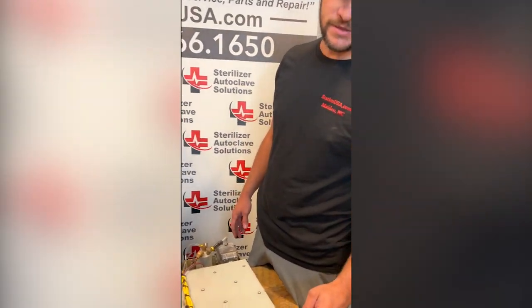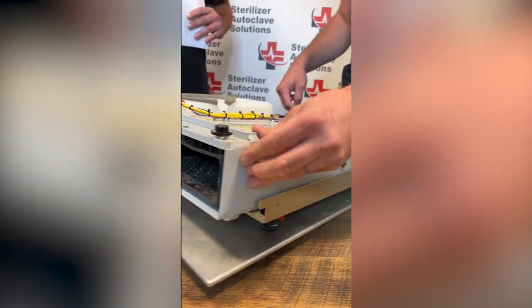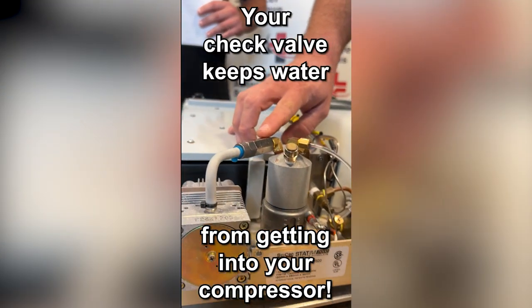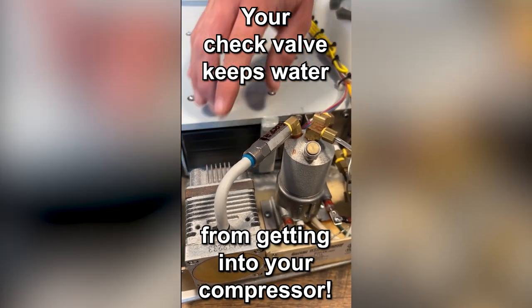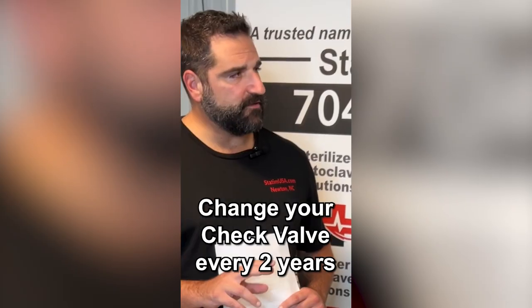He ended up purchasing a cassette seal from us. Also with that PM kit that he got, he got a compressor filter — which is back here — and also a check valve. Your check valve is important because that will keep water from getting from your boiler into your compressor. Ian, manufacturer recommendations on that check valve? Every two years.